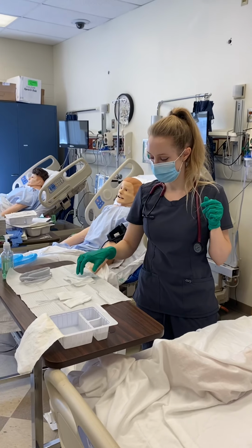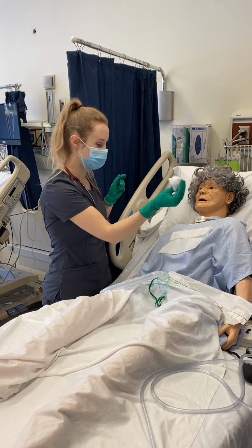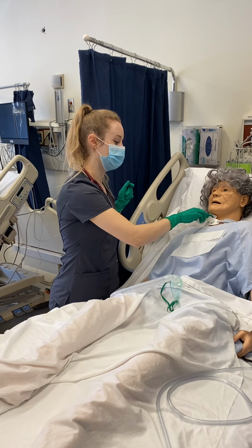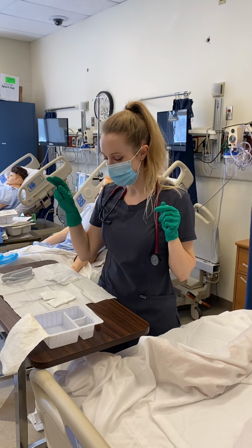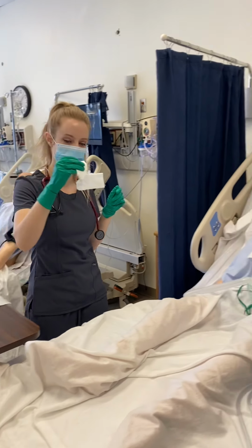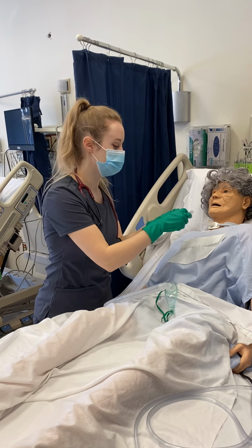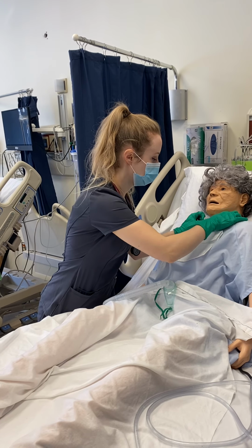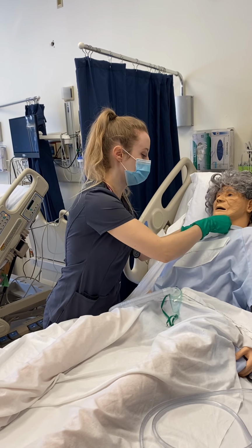I want to make sure that the area is very dry, so I'm going to take a gauze square and I'm drying around the site. Next, with my sterile hand, I'm taking my new trach square, and at this point, this is my last step, so I do break sterility here, but I'm inserting that up around the trach, making sure it's in between the trach and the skin.